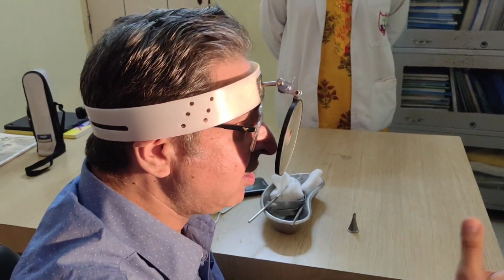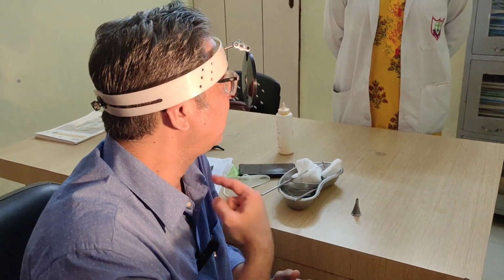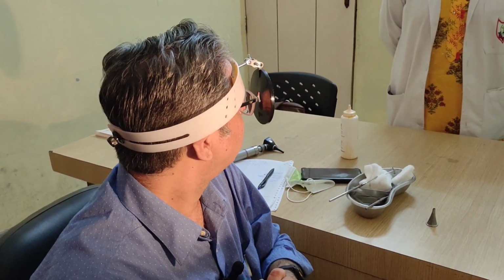In case of a perforation, if it is a wet perforation, you can see the bubbles coming out. So that shows the intact Eustachian tube function. Another way is using a pneumatic speculum. You give pressure and you ask the patient if he feels air in the throat. So all these things indicate towards a normal Eustachian tube function, right?